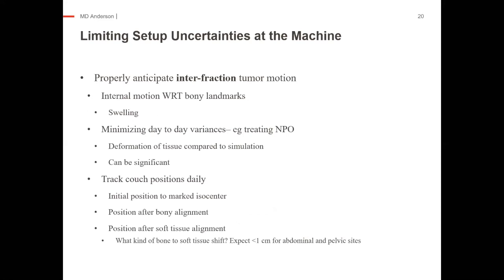There's going to be some internal motion with respect to your bony landmarks. We see this a lot with liver, which can deform in shape, so it might not quite line up to bone the same way. You can try to minimize day-to-day variances for some sites. Pancreas is one, liver to some extent, by treating NPO for, say, 3 hours beforehand. There's deformation of tissue compared to simulation for empty versus full stomach, and this can be significant.